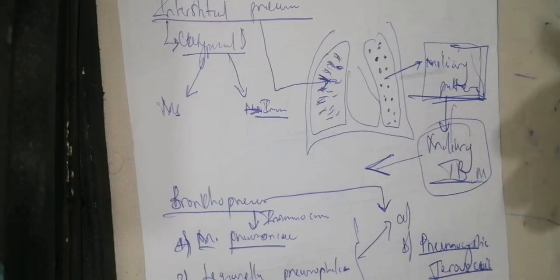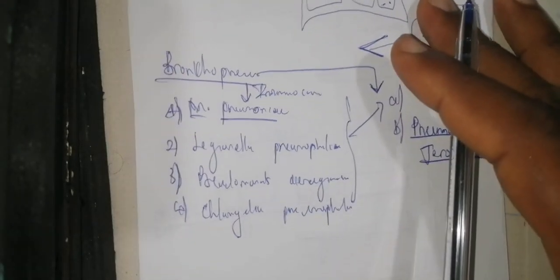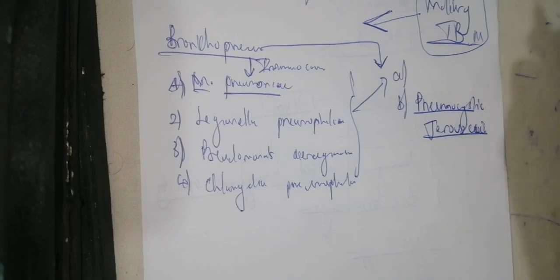X-ray, which showed miliary TB, mostly Mycobacterium intracellulare from the avian family. Is it clear? So those are the different things that you have to understand.